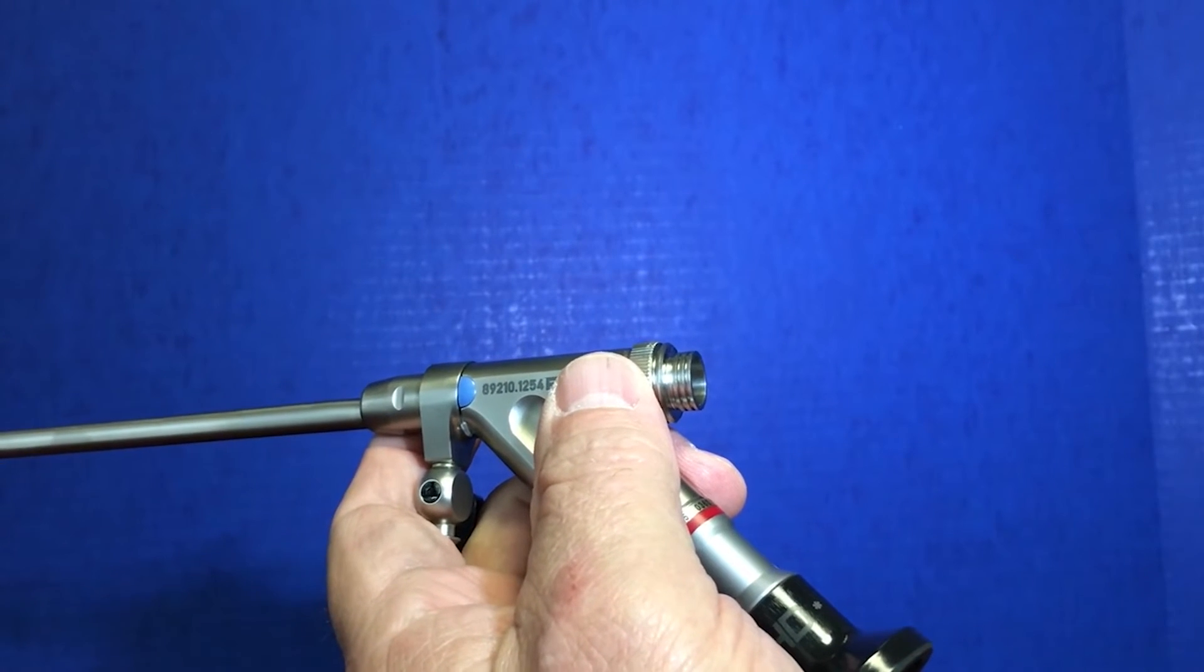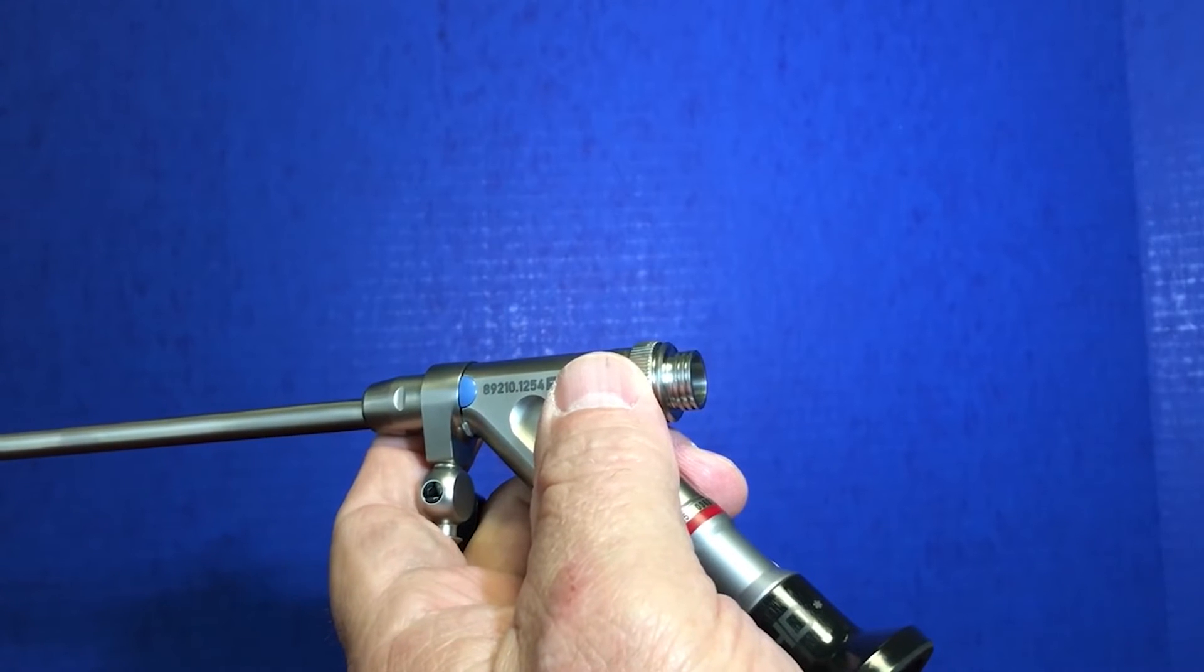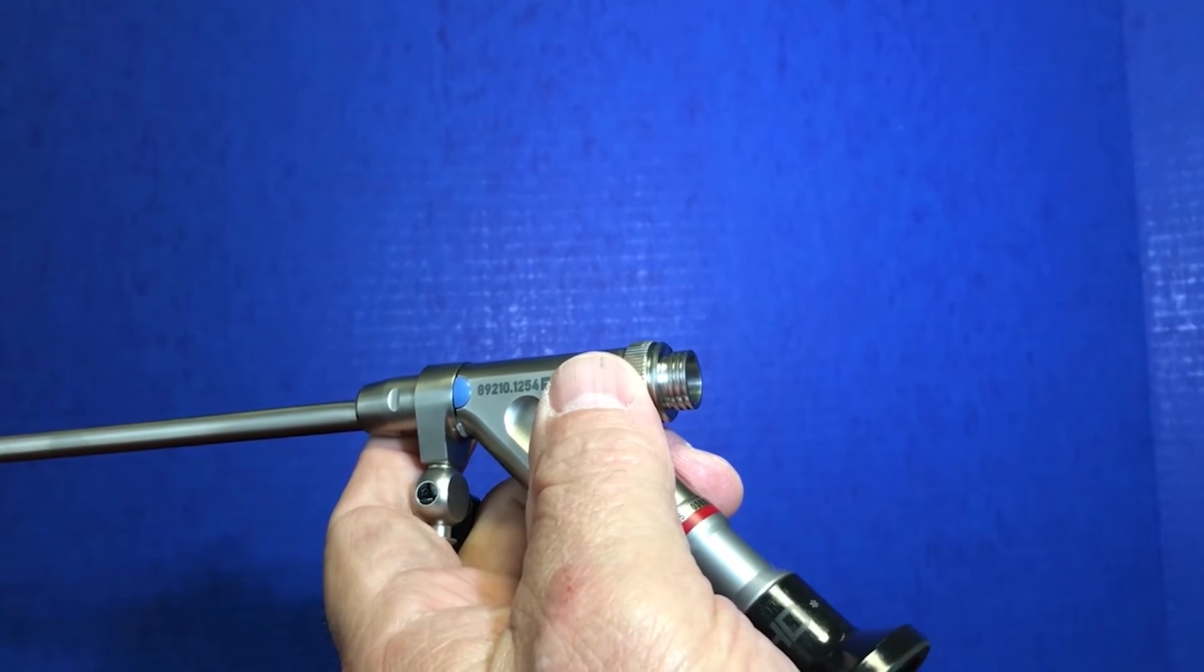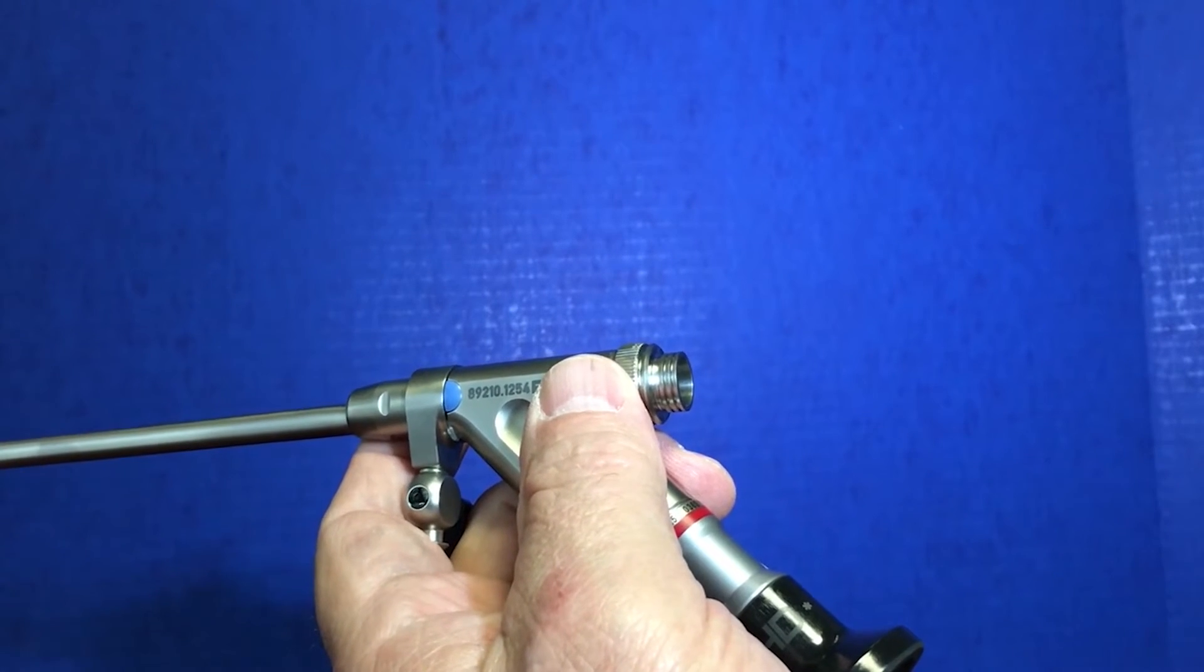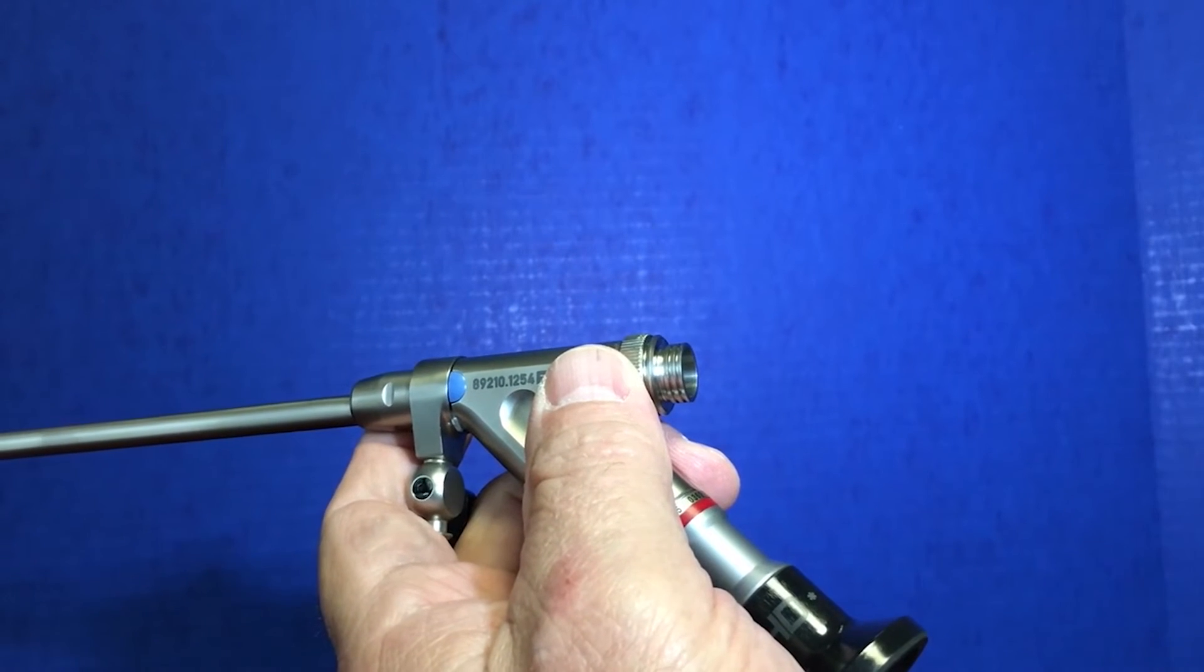So essentially you can just work with the scope as it was in the beginning with nothing at all. It's only when you're having a little bit of trouble with fluid pressure that you might want to be doing what David is now putting in here.